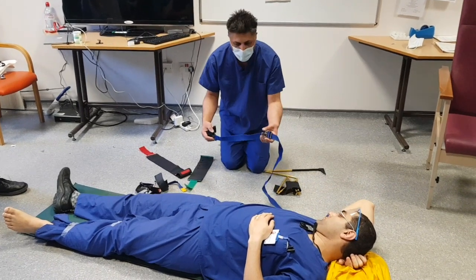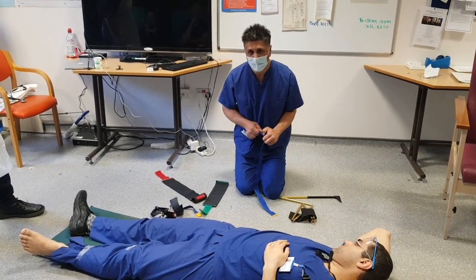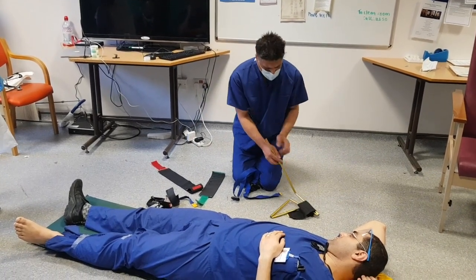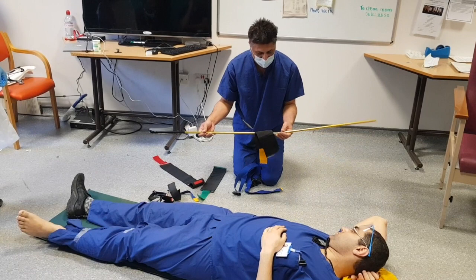The Kendrick Traction splint works by pushing up into the groin and the ischial tuberosity, and by providing counter traction on the ankle to push that downwards. That's stabilised with an external pole — like tent poles, they all click together so that we can change the height.